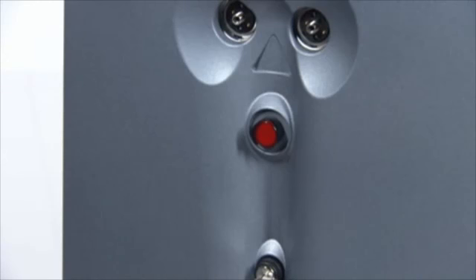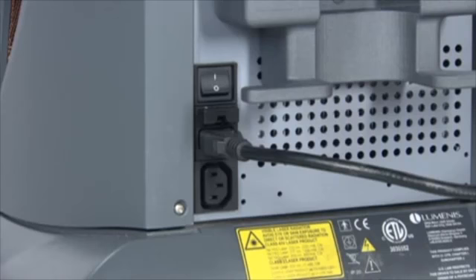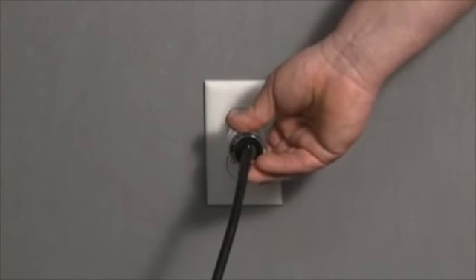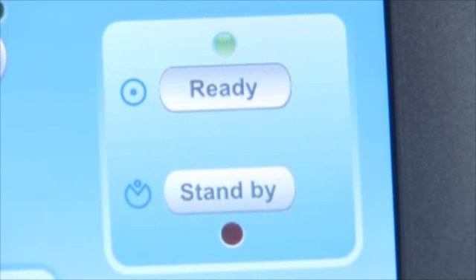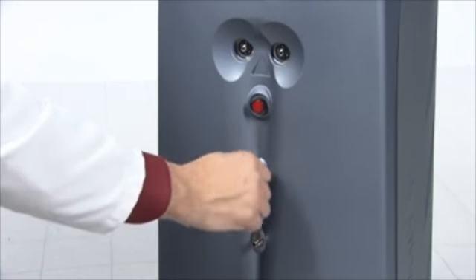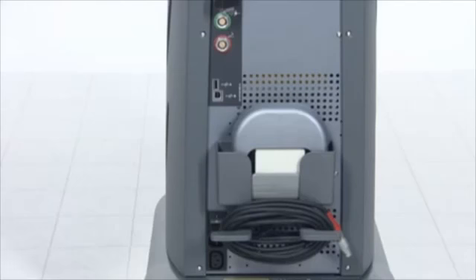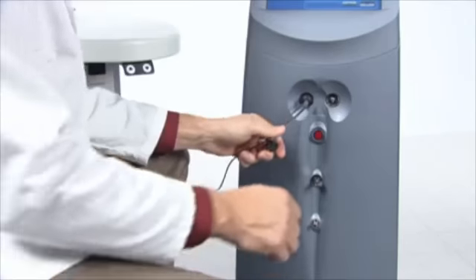In an emergency, press the emergency off button on the front of the laser console to immediately turn off the laser. When the main power cable is connected to the electrical source, some internal circuits remain energized. To de-energize all internal circuits, unplug the main power from the wall socket or turn off the main electrical service wall circuit breaker. To disconnect and store the laser components, first place the laser in standby mode, then turn the key switch to the off position. Next, unplug the main power plug from the wall socket and wrap the power cable around the cable wrap.